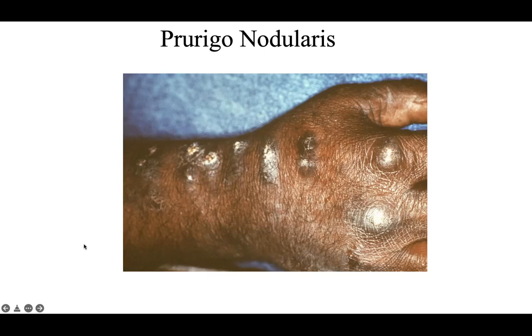And so if it's not clearly 100% cytologically a perfectly abnormal squamous proliferation that would be in the realm of the squamous cell carcinoma, but it's got enough atypia and enough endophytic architecture, then I will comment to say that although a lot of this is prurigo nodularis, there's some areas that are definitely concerning, and recommend a conservative but complete excision to make sure you have negative margins.